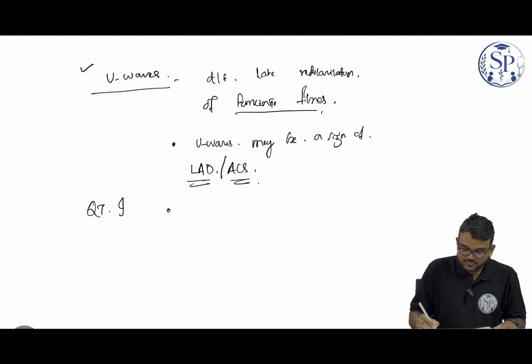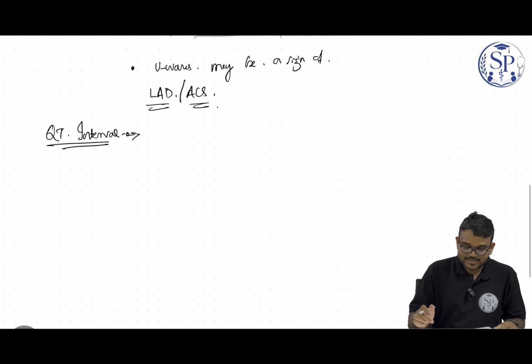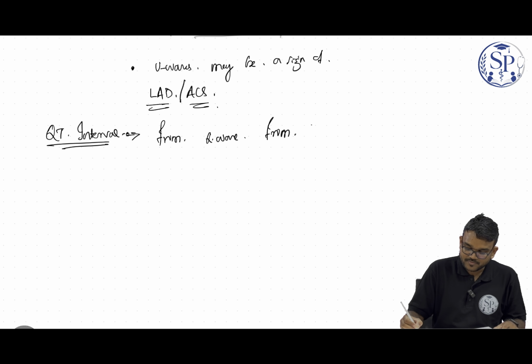Now coming to QT interval. The QT interval signifies from the starting of the Q wave to the end of the T wave.